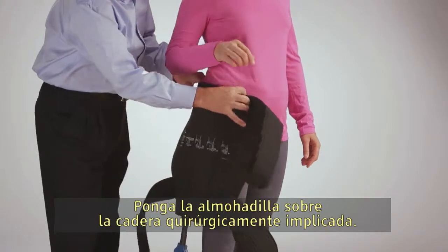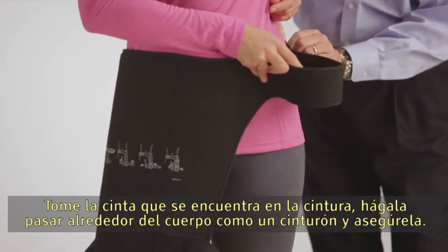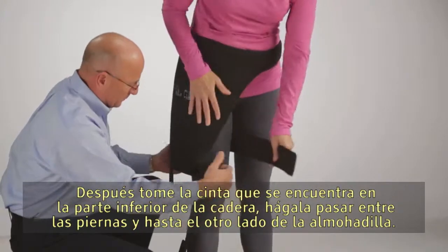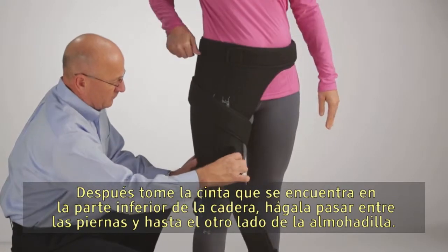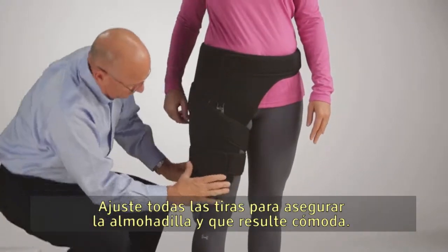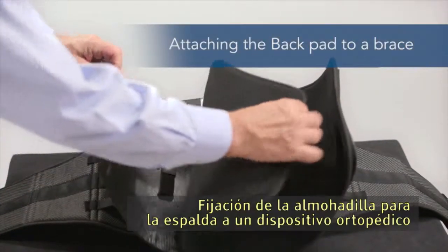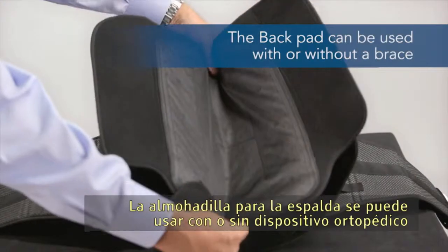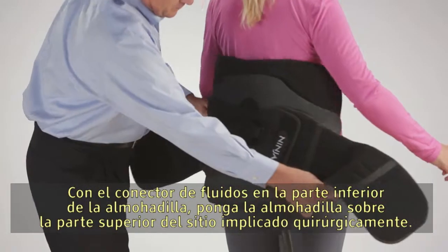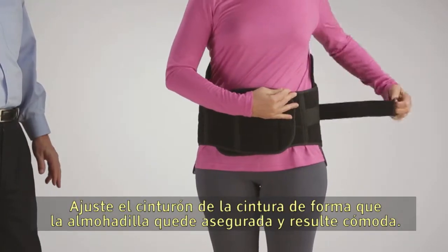For the hip pad, lay the pad over the top of the involved hip. Take the strap located at the waist and run it around the body like a belt and secure it. Then take the strap located at the bottom of the hip and run it between the legs and across to the other side of the pad. Repeat this action with the strap around the lower thigh. Tighten all straps so the pad is secure and comfortable. With the fluid connector at the bottom of the pad, lay the pad over the top of the surgical side and tighten the waist belt so that the pad is secure and comfortable.